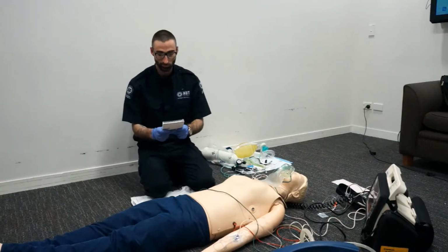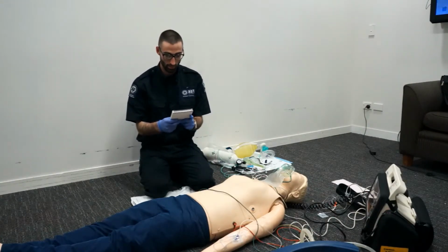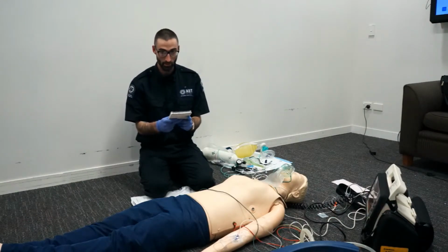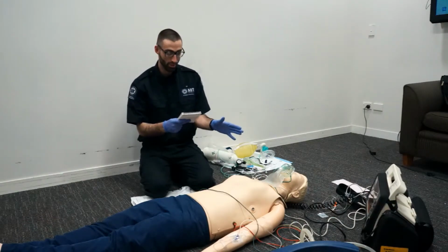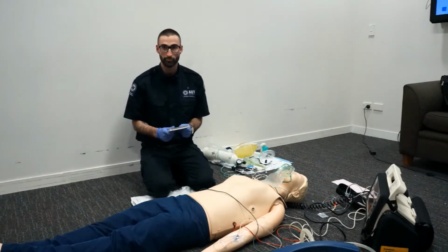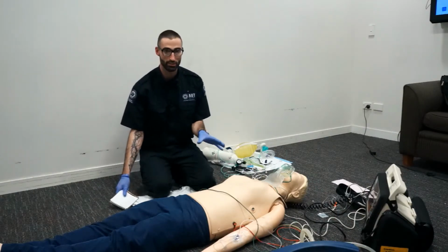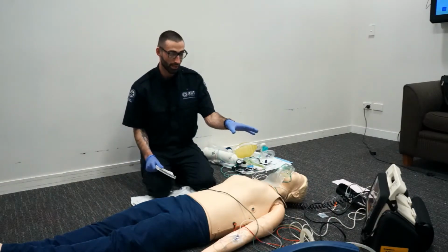Pre-oxygenate using a reservoir mask at 10 litres per minute or a manual ventilation bag at 10 to 15 litres per minute with PEEP set at a minimum of 5 centimetres of water. Okay, we're pre-oxygenating with a reservoir mask at 10 litres per minute. Attach ECG, NIBP and SpO2. Okay, so we have our 12 lead attached here and we're monitoring the cardiac rhythm.